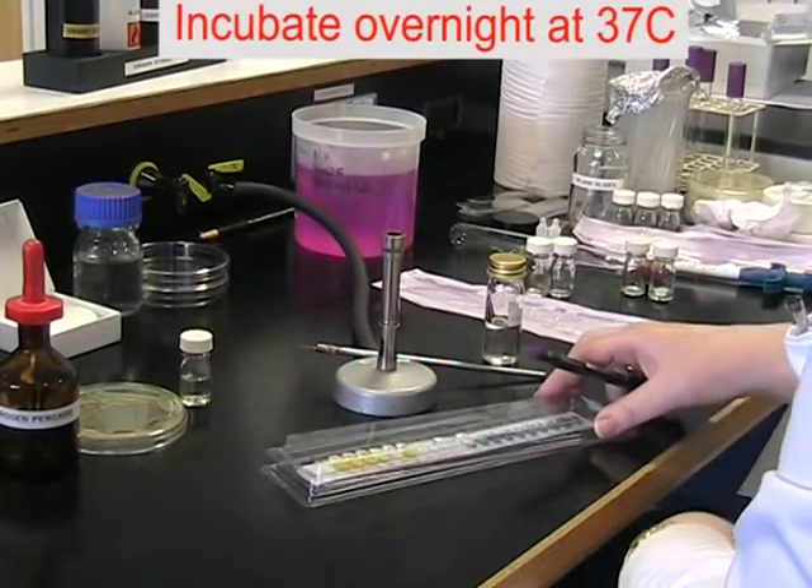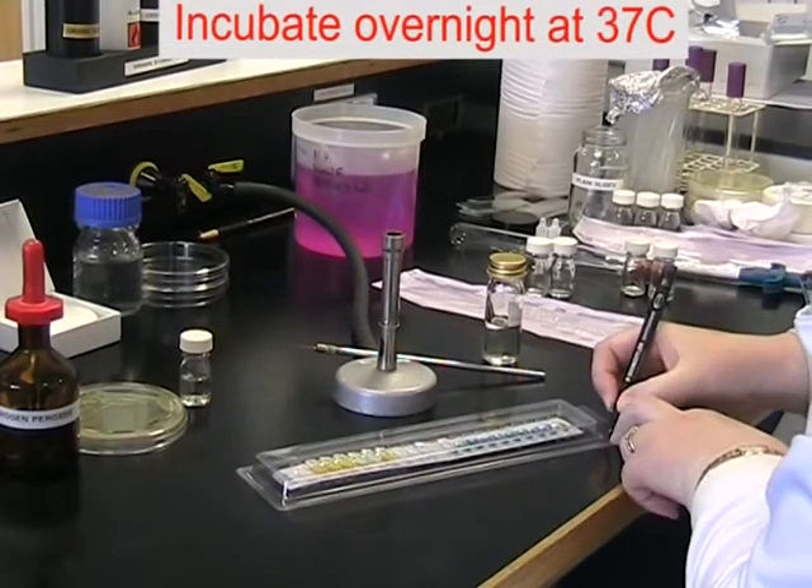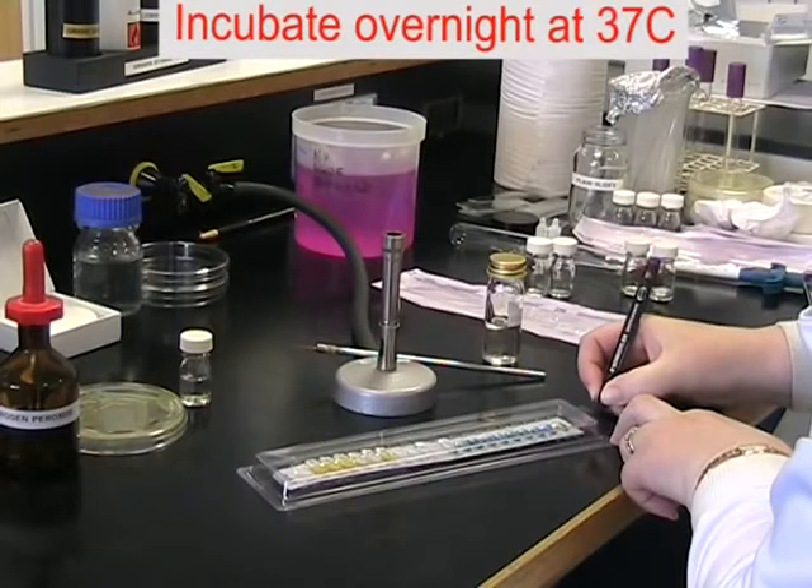Cover your strip with the lid provided. Label with your name and place for incubation at 37 degrees overnight.